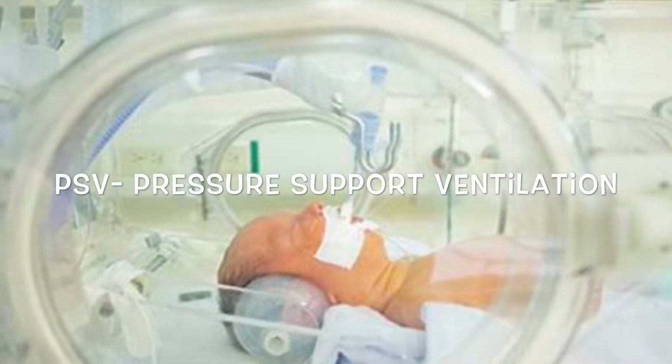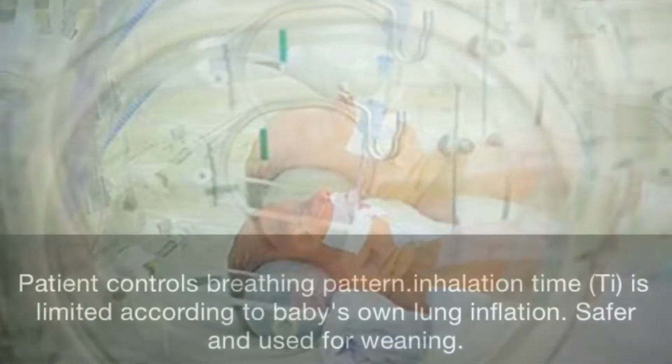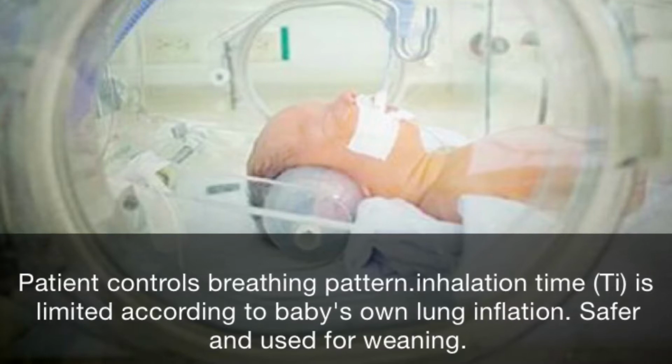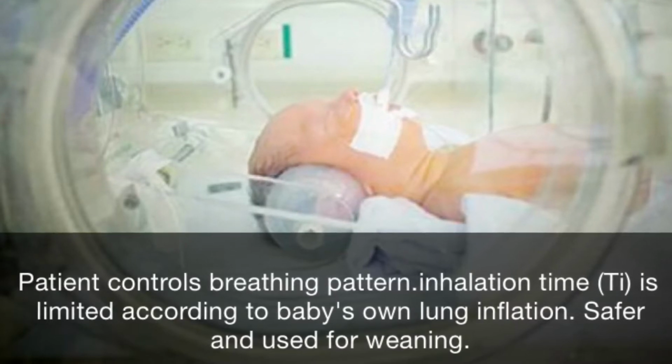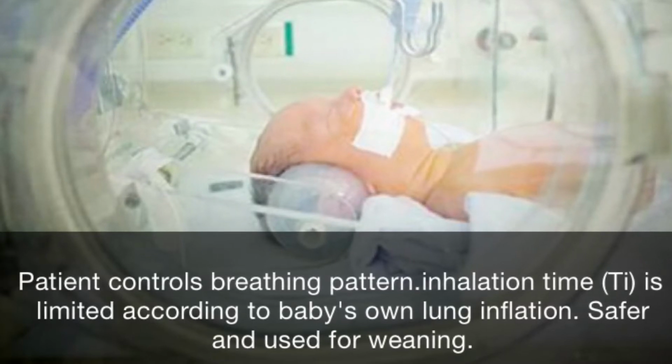PSV or Pressure Support Ventilation. The patient controls the breathing pattern. Inspiratory time is limited according to the baby's own lung inflation. It is safer than AC mode. It is used for weaning.